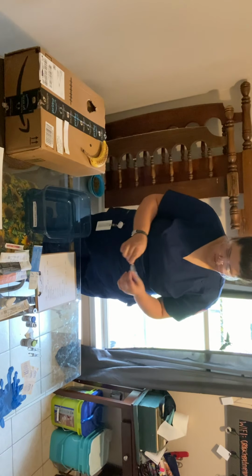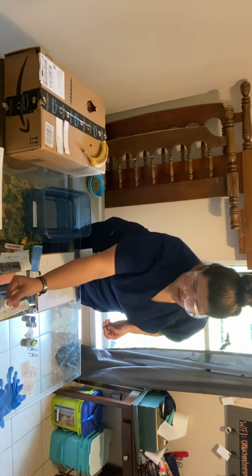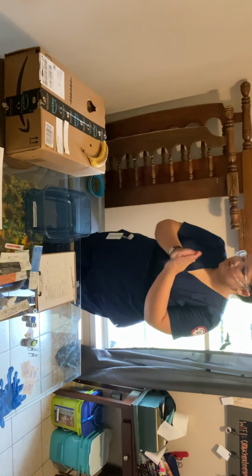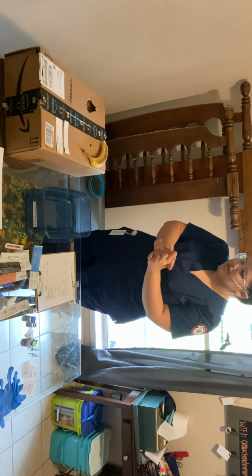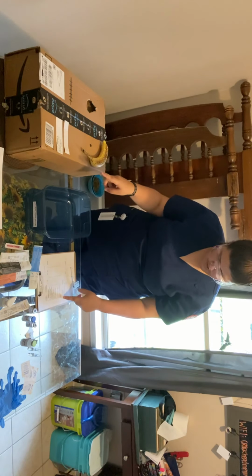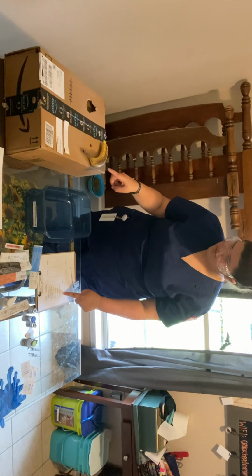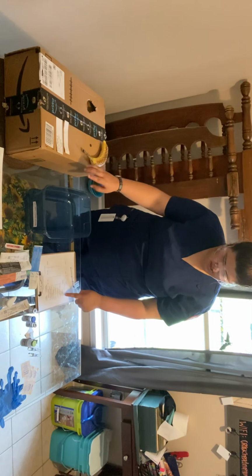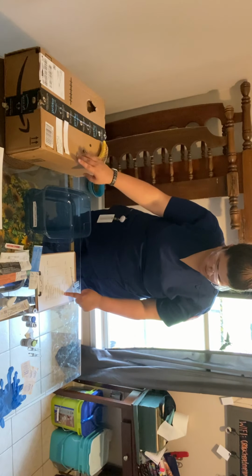I would start by entering. I'm going to perform hand hygiene. Hello, Mr. Jones. I'm Sarah Layton. I'm going to be giving you some heparin today. I'm just going to verify that I have the correct person. I have Mr. Jaguar Jones. Date of birth is 8/25/1963, and I have 8/25/1963. And his medical record number is 417-6352, and that matches my 417-6352.